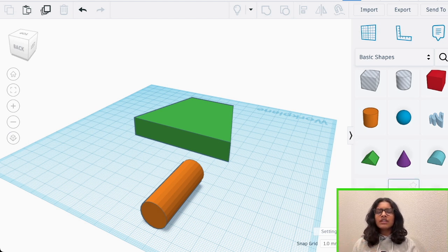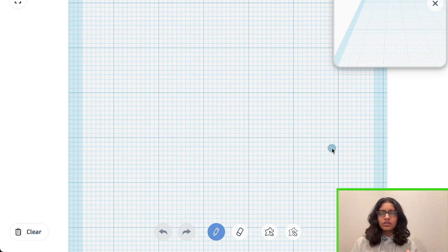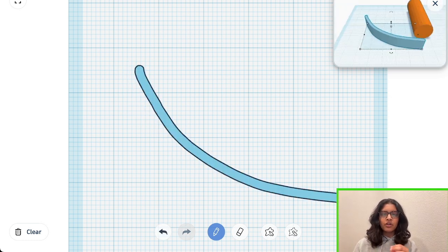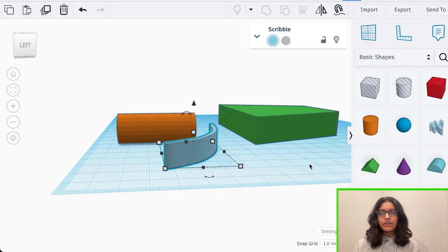And so to do that in TinkerCAD, we're just going to be using the scribble tool. Draw the curve you want to put onto your finger with this scribble tool. We're going to use this to carve the curve that we want on each one of our fingers. Click done and your scribble should be on the 3D work plane. Now the next thing you want to do is orient your curve to be how you would look at your finger from a side profile.